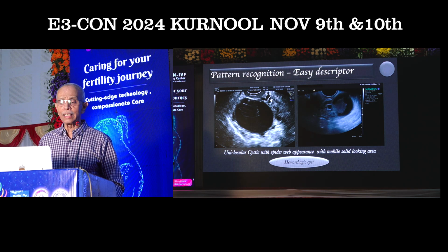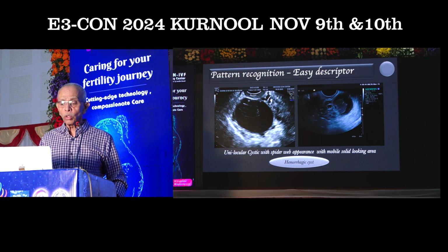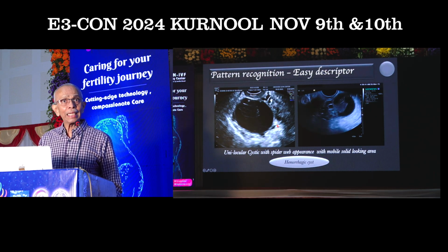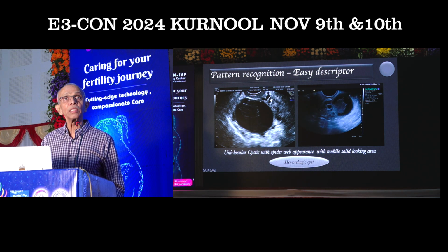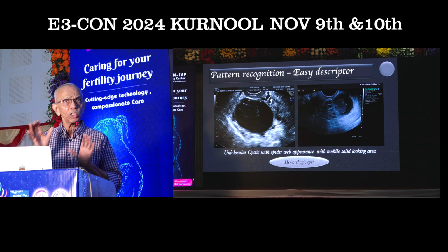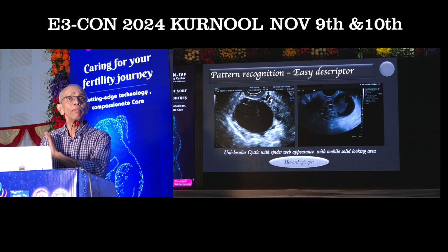This is a classical easy descriptor. Once this imprints in your mind, there is no way that you are going to miss this one. So here we have a well circumscribed unilocular cystic area in a premenopausal woman with what is called the spider web appearance, isn't it? These are all thin septations which are seen. Now I am using the same transvaginal transducer. I am trying to push the solid looking lesion, which is wobbling with my pushing. So this is a clot. This is a typical appearance of a hemorrhagic cyst. Once you have identified the features suggestive of a hemorrhagic cyst, this is what is called easy descriptors or pattern recognition. This pattern can never be forgotten.